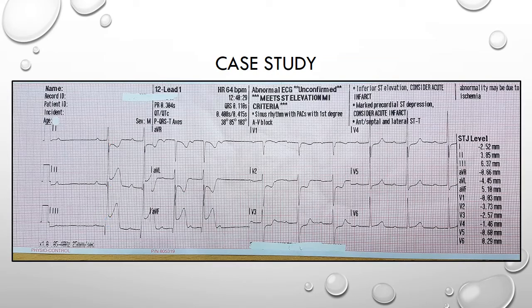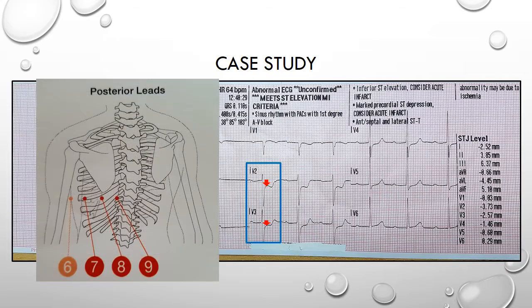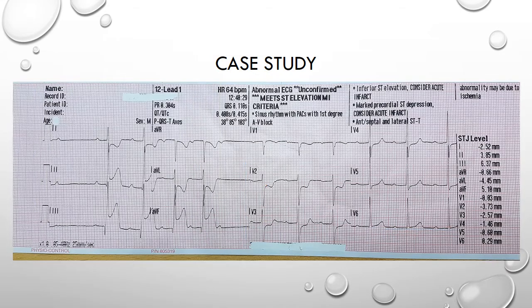We also have ST depression in leads V2 and V3 with tall R waves and upright T waves, which suggest posterior involvement. Normally we would go ahead and record V7 to V9, but if you look at lead V6 we can see some slight ST elevation. Together with the findings in V2 and V3, we can say there is posterior extension, because lead V6 is positioned towards the posterior leads in the mid-axillary line.